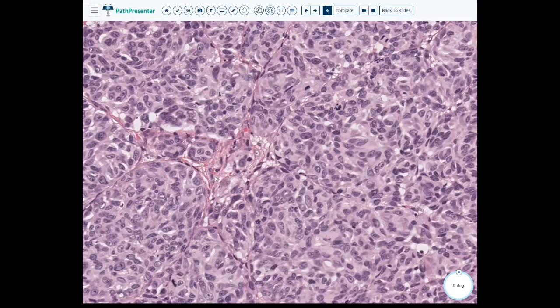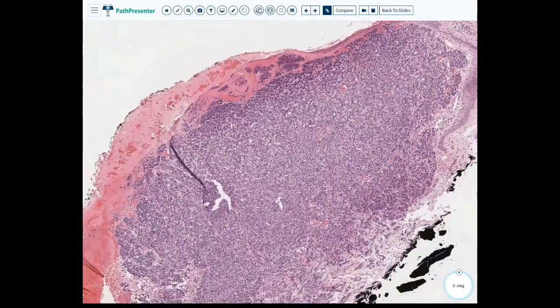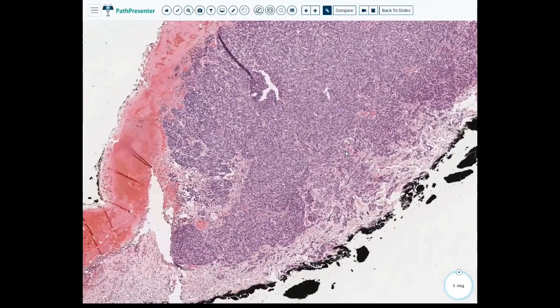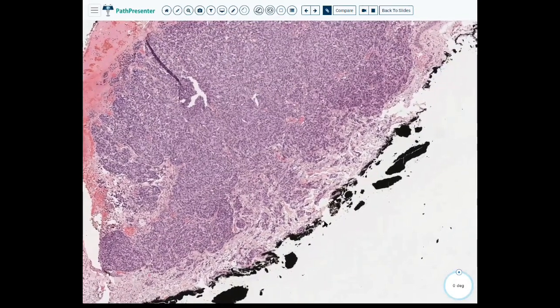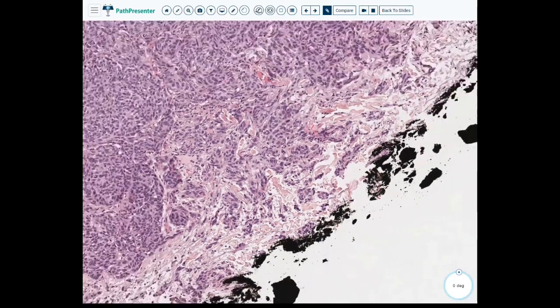We do have relatively prominent nucleoli. These ones even look that cherry red, that dark cherry red that we associate with melanoma. Here's another macronucleoli, and it's in this nodular pattern. So we definitely have melanoma, and it is nodular. So we would just call this malignant melanoma nodular type. And right there, you can see it's on ink, so we'd have to mention that too.